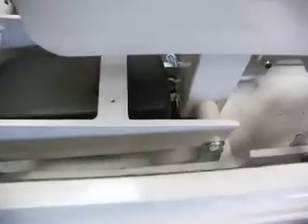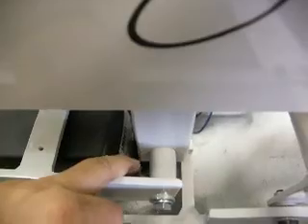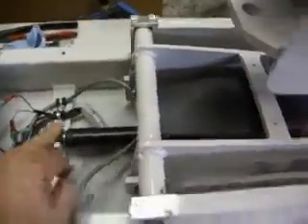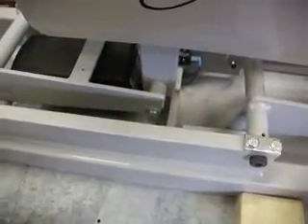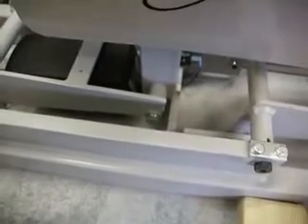This video will provide instructions to remove a linear actuator where the front mount has been broken due to mishandling. Mishandling in this case is that as the table is shipped, the table is blocked in such a way as to remove any load that could be placed on the linear actuator during transit. In addition, it removes any load placed on the linear actuator during the delivery and location process.